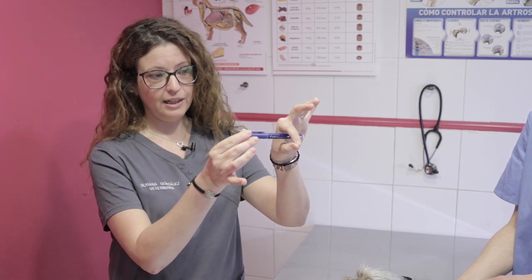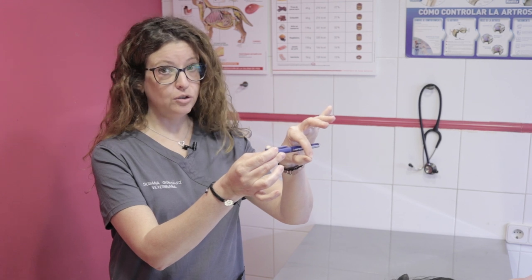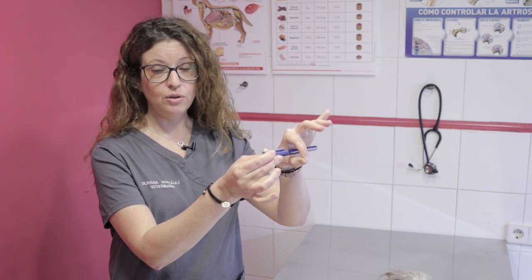For an accurate reading, we must insert the thermometer straight, but then push it to the side so the tip will touch the wall of the animal's rectum. If we leave it in straight and there is fecal matter present, it will take the temperature of the feces instead and provide an inaccurate reading.